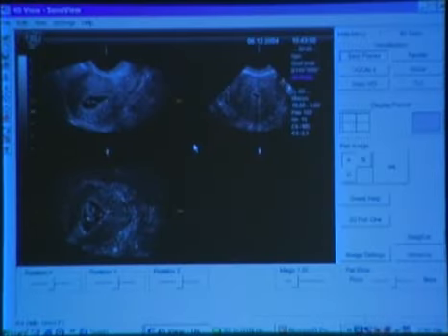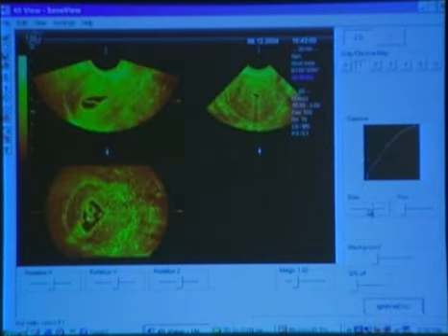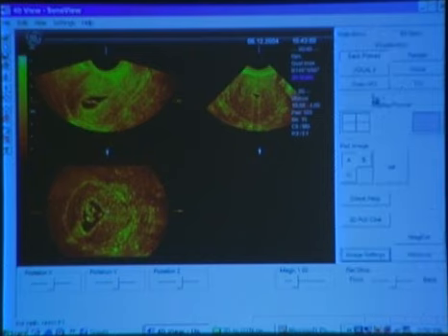The tomographic image display, as it was explained, is important, and let me just go to a volume that I have up here and show you a little bit how that's done. This is an actual volume, and saline was put in to see whether there are any polyps inside. First of all, I like to see them in a little different color, but you can do it whichever way you want. Then you go back and you can display it in the tomographic fashion.